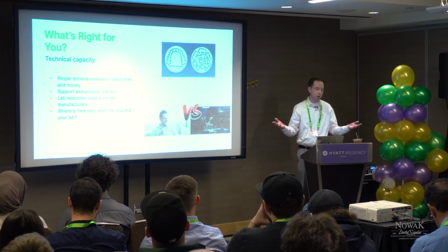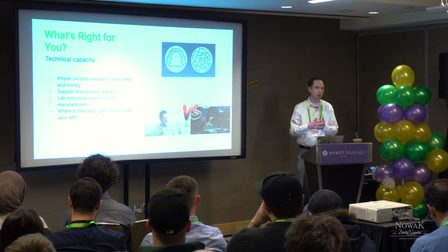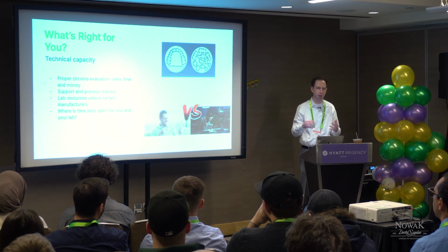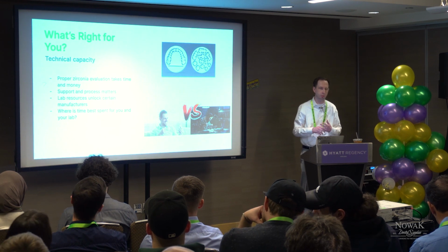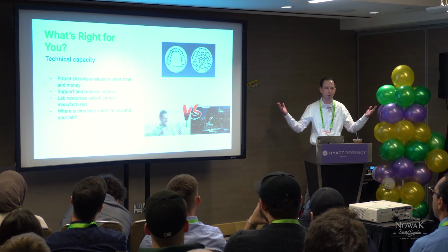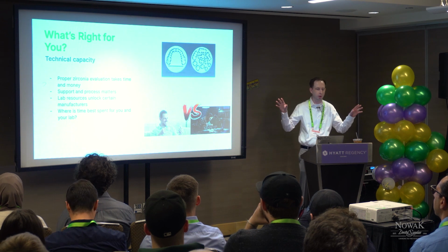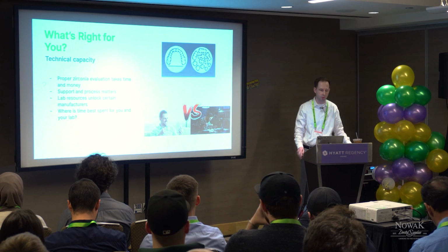But what's right for you in your lab? I mean, this is really where the rubber meets the road. How much do you want to evaluate zirconias, right? How much testing? How do you choose material is really testing, milling, and comparing, right? A pretty simple process of, I'm considering these two brands of materials of these classes, but this is the class that I need to solve in my lab, or it's a hole in my lab, right? Mill the same two crowns and evaluate them. Have all your techs look at them and evaluate them, right? But that takes time and money.